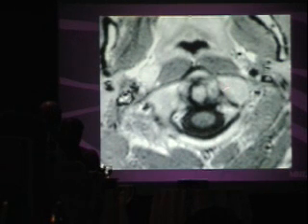Okay? There's one node that is Dr. Eucurnan's favorite node, probably deserving of special reference, the node of Rouvier. In general, lymph nodes that are abnormal are enhanced, slightly T2 bright, and may have necrotic centers. There's probably 3 criteria you would use to describe an abnormal, potentially malignant lymph node: size, shape, and internal density.